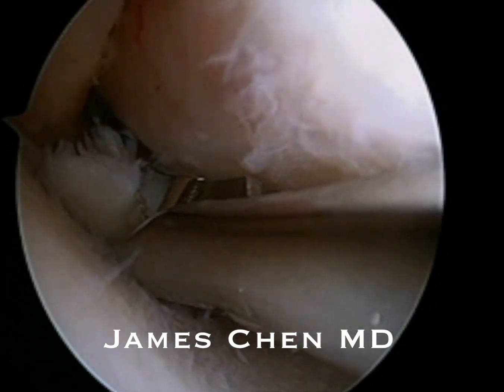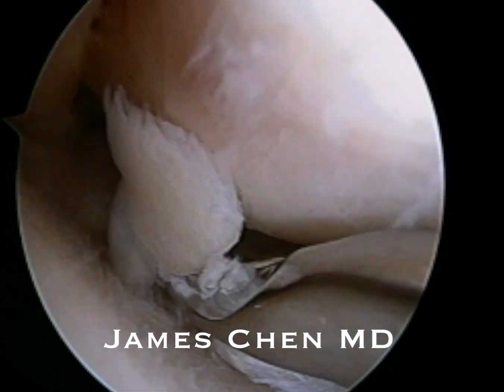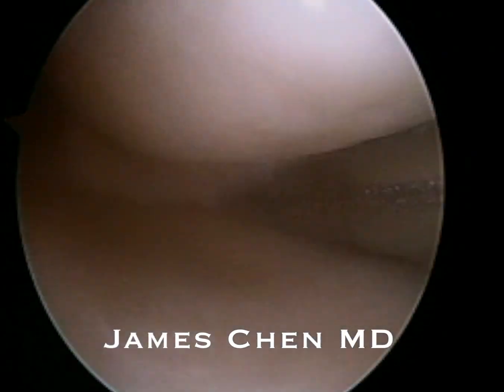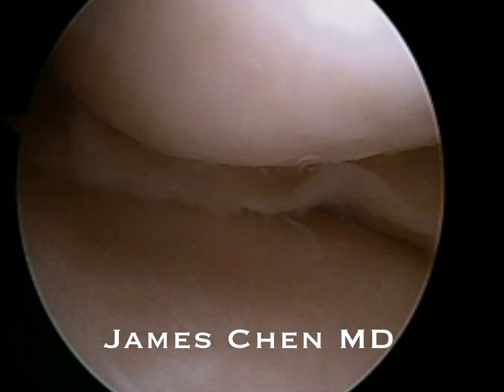Here I am using a basket biter to remove the flap of tissue that is causing mechanical symptoms. I then follow with a shaver to debride the tear and clean off the edges. I want to leave as much meniscus remaining as possible.